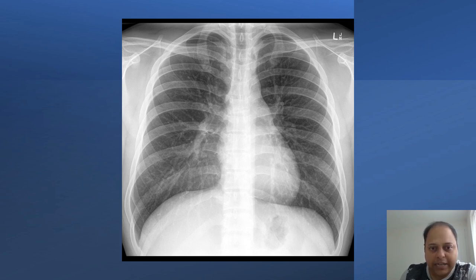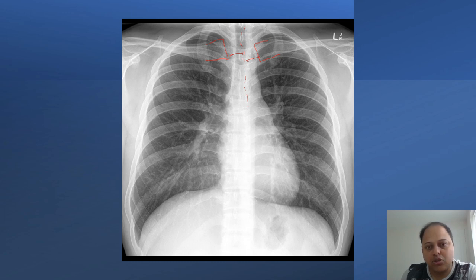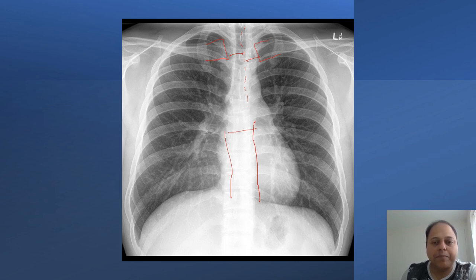To assess rotation, measure the distance between the medial end of the clavicle on both sides and the spinous process — this distance should be equal on both sides. If it is a rotated film, the distance will be unequal. The next thing to note is exposure. You should be able to see the vertebrae behind the heart in a properly exposed film. If it is overexposed, the lung fields will appear more black and may mimic the appearance of emphysematous lungs.